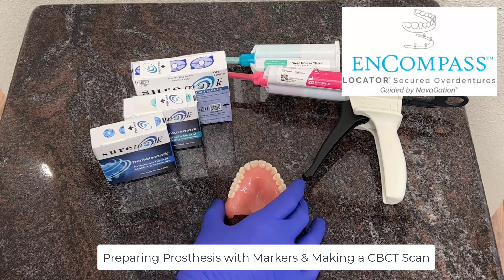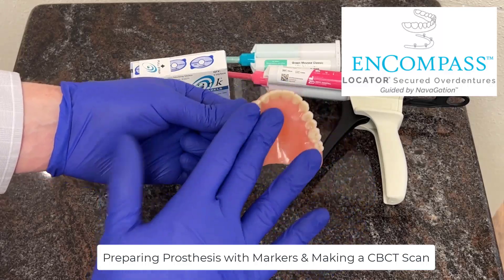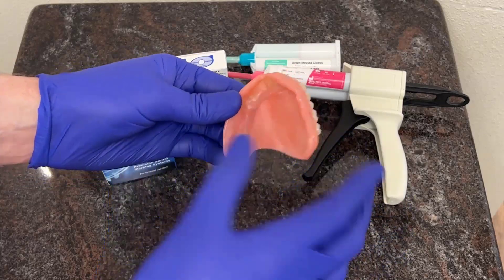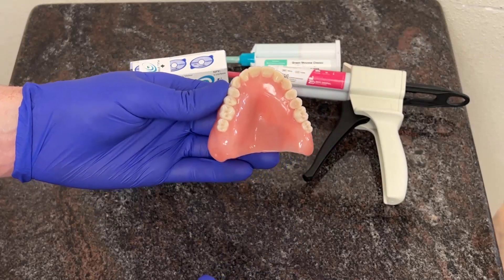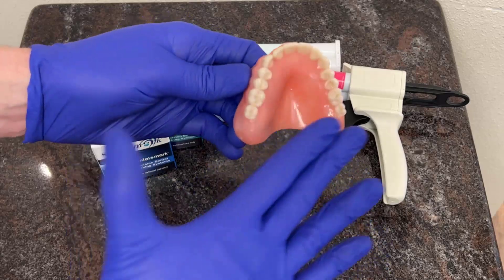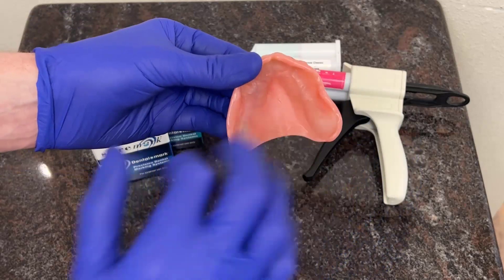When we're ready to prepare our denture for our Zest and Compass case, first and foremost we want to make sure the denture prosthesis is in good shape. Minimal metal on the inside, a well-fitting denture, and one that is about right for the patient. We can make some changes to the incisal edge position, tooth color, and tooth shape, but we want to make sure that the centric and vertical is about right and the denture fits pretty well.